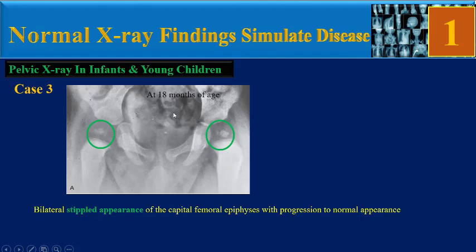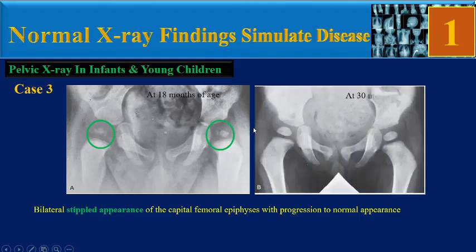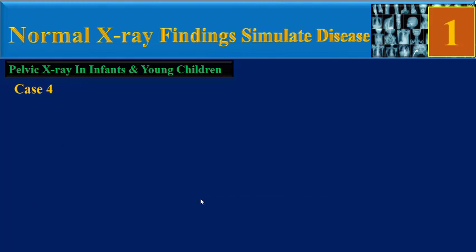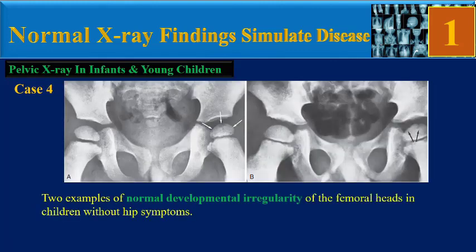Case 3: bilateral stippled appearance of capital epiphysis with progression to normal appearance. This image is at 18 months of age, and this one is at 30 months of age.